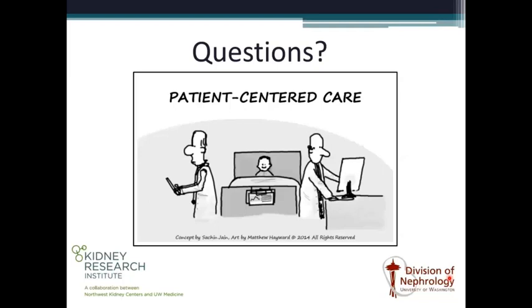Practically speaking, give me an example of a patient I might see in cardiology clinic on whom I should order an ABPM. So I would order an ABPM on a patient that you see if they're very hypertensive, if they have resistant hypertension, and they're reporting any blood pressures in any environment that are lower. So if you're concerned about a real white coat effect, you don't want to drive their actual home blood pressures lower by intensifying their therapy.